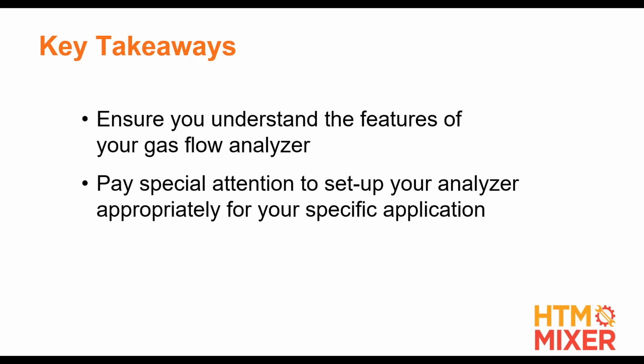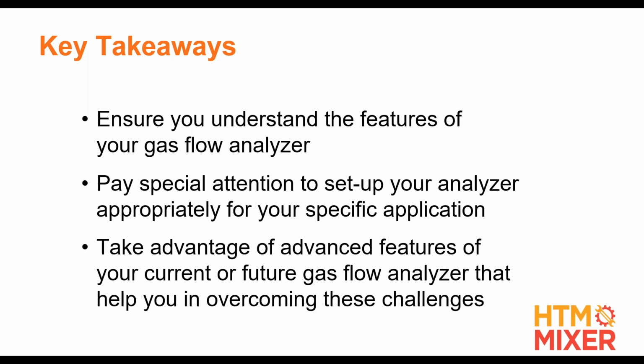Pay attention to how the setups are. A lot of times the manufacturer will say "or equivalent." They may have gone a long way down the road showing you one analyzer, but you can do "or equivalent," and then it's up to you to figure out how to do it with your analyzer. Take advantage of all the new features on the new analyzers. It's getting so nice. If you can see graphics on the screen and the number of parameters and numerics, you can go a long way getting things dialed in. They should help you with some of these problems.